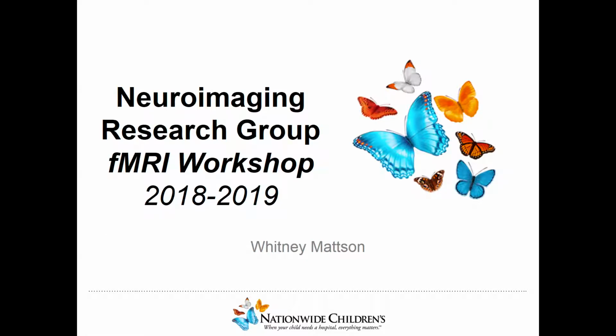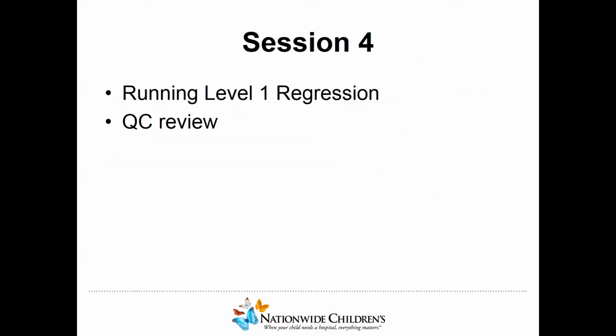Okay, so this is our fourth session, and I'm going to dive pretty quickly into the steps we're going to run through today because there's a fair amount to cover. At the last point, we had reviewed all of the steps in running our level 1 regression models.